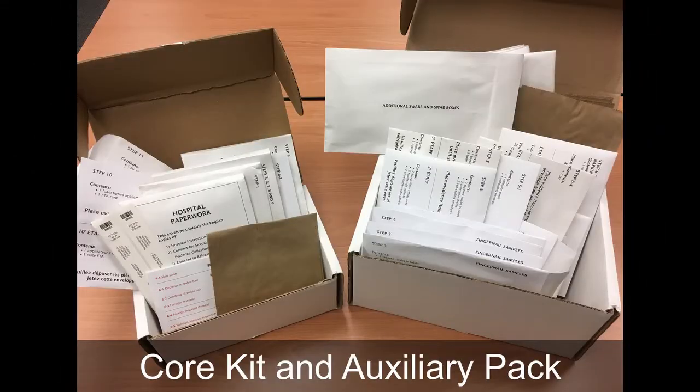The sexual assault evidence kit is comprised of a core kit and auxiliary pack, and is used to document the collection of physical evidence that may assist in the investigation of a sexual assault. Core kit, the smaller box on the left, and an auxiliary pack, the larger box on the right-hand side. Each of these kits contain a series of envelopes that are going to be used in the collection of forensic evidence.